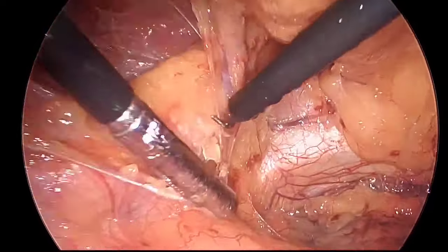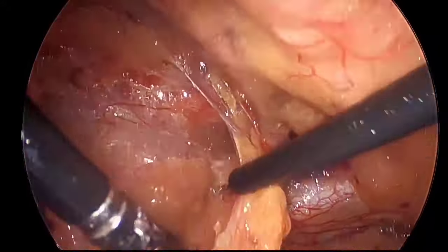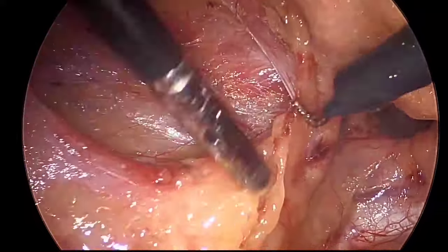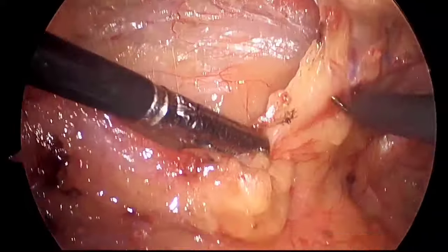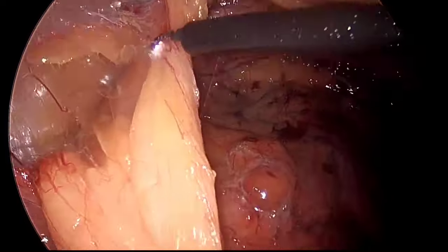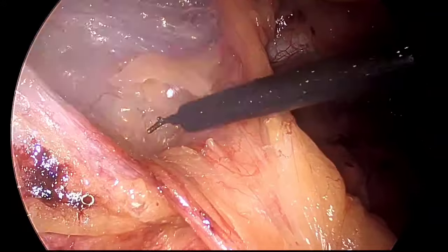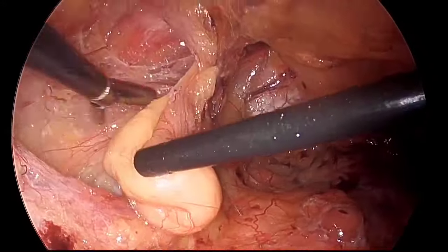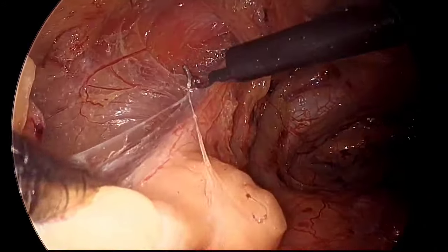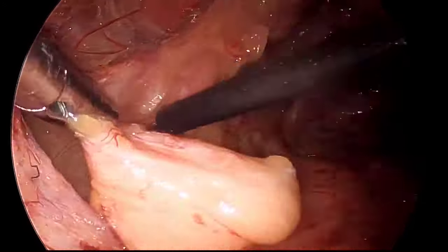So again, in any particular inguinal hernia repair, we should always look for a presence of cord lipoma, and that should be dissected off. Otherwise, there is a chance of postoperative persistent bulge in the groin area. So now I'll be pulling the cord lipoma towards the dissection area. You can see good amount of traction with the left hand instrument, and then with the hook and monopolar energy I'm dissecting it off from the cord structures.